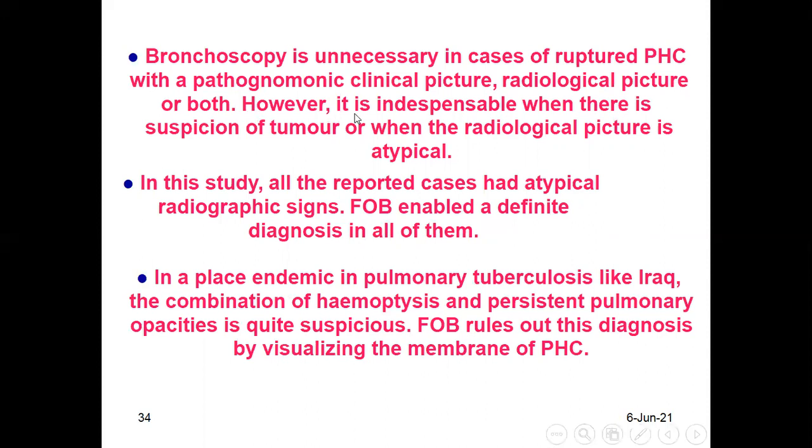However, it is indispensable when there is suspicion of tumor or when the radiological picture is atypical. In this study, all the reported cases had atypical radiological signs. Fiberoptic bronchoscopy enabled a definite diagnosis in all of them.